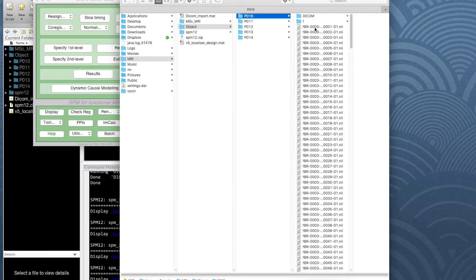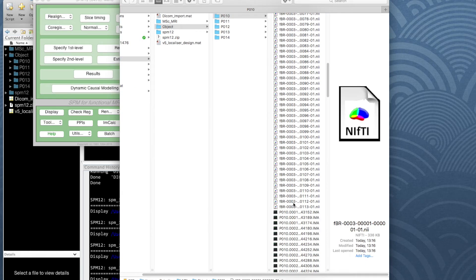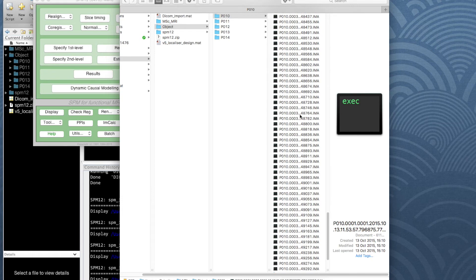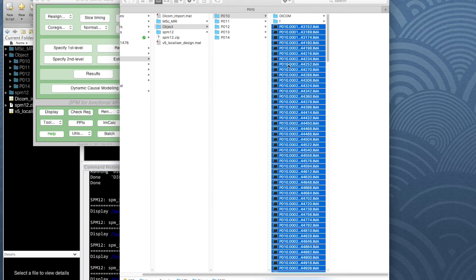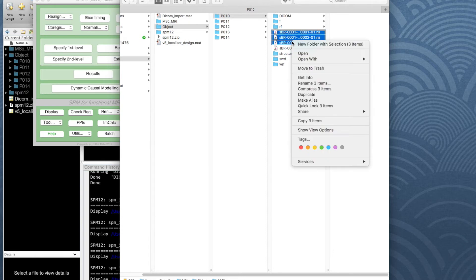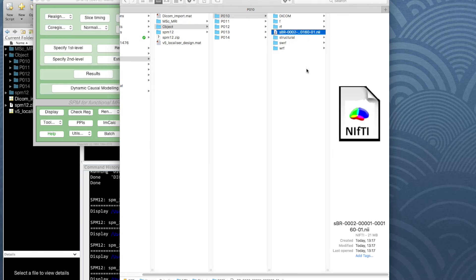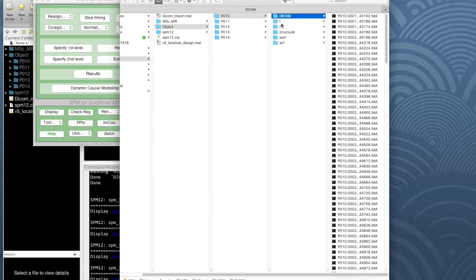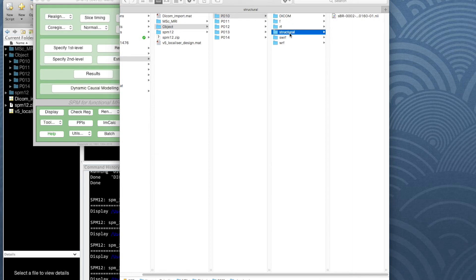For participant 10, I just select all the functional images and pop them into the F folder. I take the original DICOM images and put them in the DICOM folder. The three localizer images I don't need — I'll put them in the trash. I can still get them back if needed because I have the original DICOM images, but we're not going to use them. What I definitely want is the high-res structural image, so I'll put that in the structural directory. Now I have DICOM images converted to functional and the structural, with the remaining folders ready for the next steps.